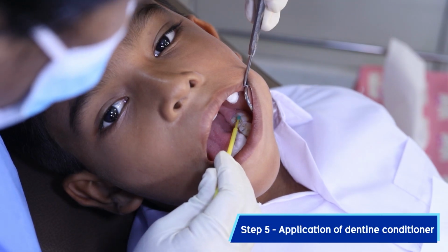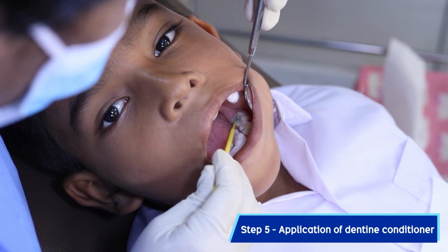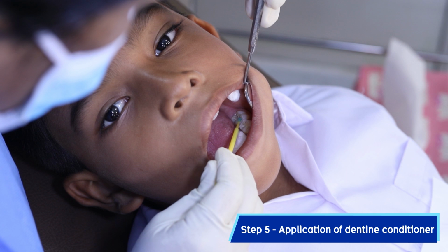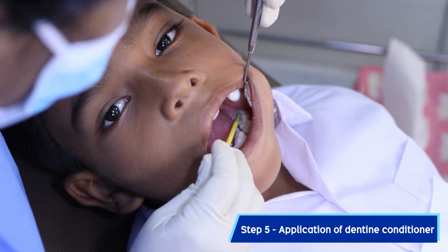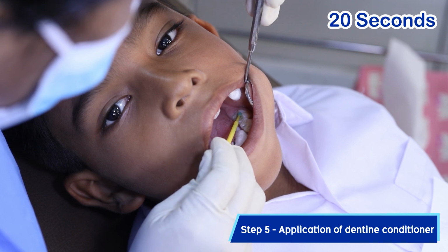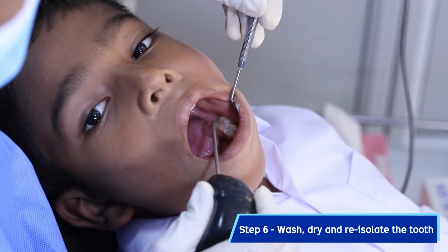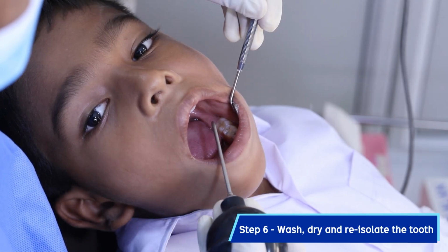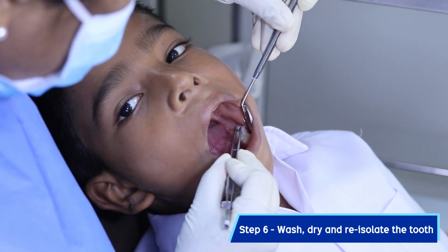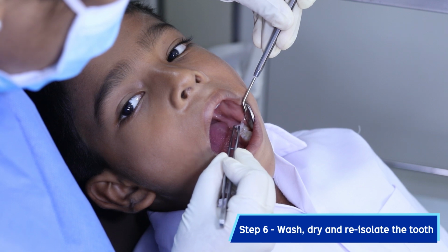Following the manufacturer's instructions, apply dentine conditioner on the pits and fissures to be sealed with a microbrush and wait for 20 seconds. This will remove the smear layer. Wash the tooth with water using a chip syringe. Dry the tooth with cotton wool and isolate the tooth as mentioned in the previous step.